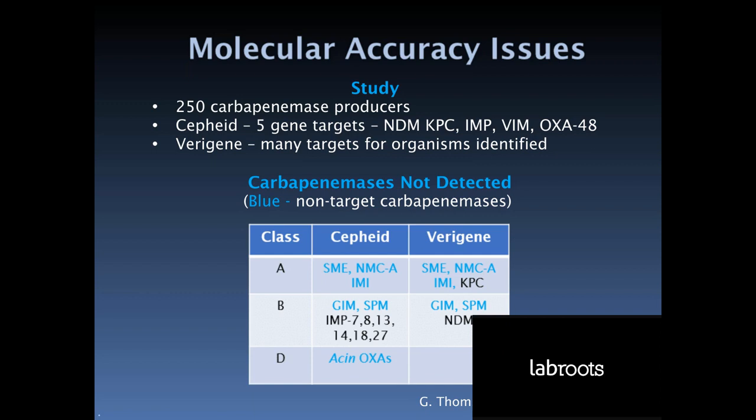So summing up all this, molecular tests are helpful if you get a positive result. Unfortunately, their target ranges are not keeping up with what's happening with antimicrobial resistance. They are not standalone tests.